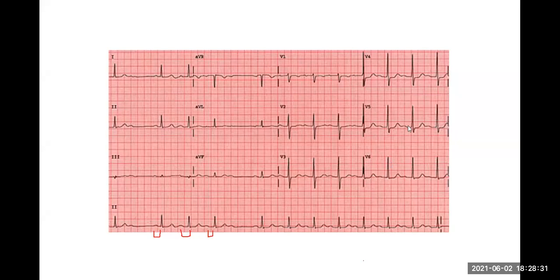So there are some other questions. Imalka is asking, can we predict whether the ECG, whether QRS will convert to a pulse? No, you can't do that. You can't predict whether a QRS will convert into a pulse by looking at an ECG. There can be electrical activity but no pulse. So that is difficult to say.